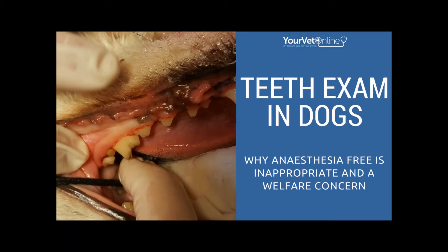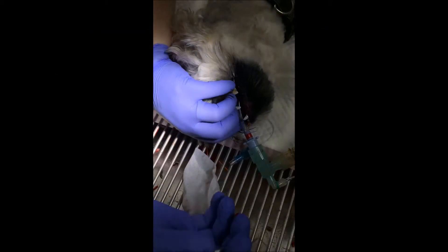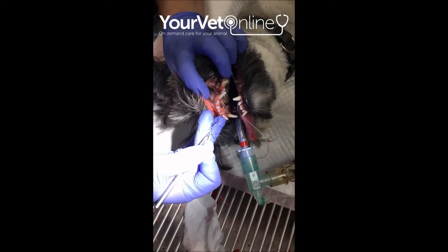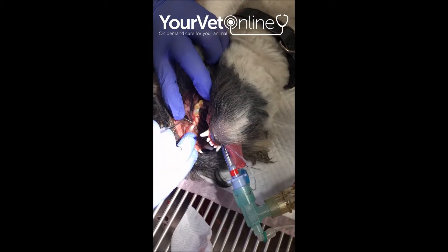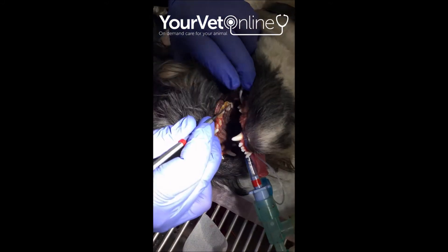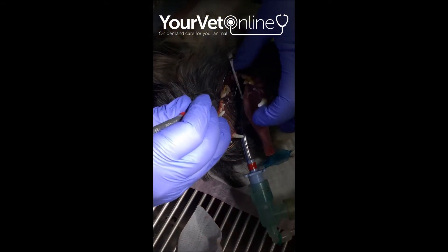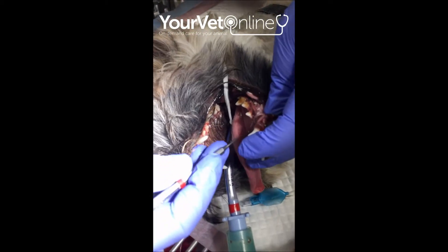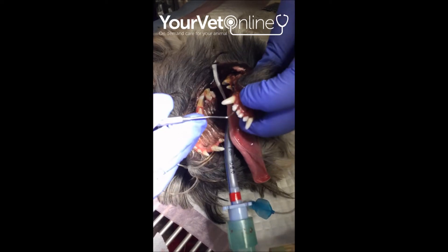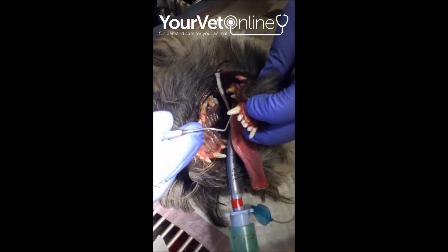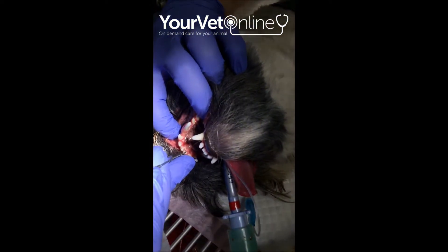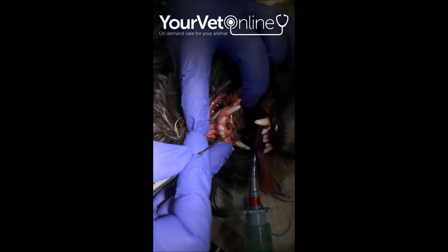In this video we're going to show you how a complete dental exam is performed in an anesthetized dog. To start with, the vet counts all the teeth and makes sure that the appropriate number of teeth are present. If there are any extra teeth or there are teeth missing, this is noted because this can cause quite serious issues later on and can affect how the mouth opens and closes, and may also lead to the development of tumors and cysts that can severely affect the jaw.